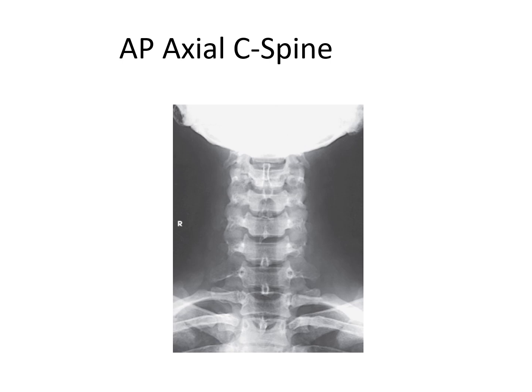You might actually clip part of C3. I've seen that happen. The way that that happens is you don't tip the head back either enough or you tip it back too much. If you don't tip it enough, the mandible gets in the way of C3, but if you tip it back too much, the occipital bone, the base of the skull, the back of your head gets in the way of C3.